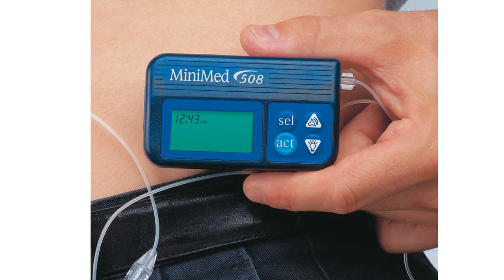And this is a very old picture, very crude, very simple type of insulin pump. They're much more sophisticated now. We have a faculty member who is a type 1 diabetic, and she has such a nice pump. I think she said her pump was listed for about $2,500, but it really is quite an incredible device in which it beeps and alerts her if her blood sugars start to go outside that parameter that she sets, and she can also look at kind of a trend and how her blood glucoses have run.